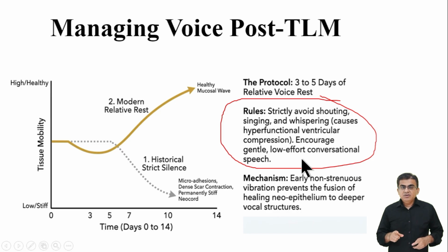However, you must give your patient very strict rules. They must absolutely avoid shouting, singing, and clearing their throat. Most importantly, you must strongly warn them never to whisper. Whispering is very dangerous after laser surgery. Whispering causes the throat muscles to squeeze too hard. This badly damages the healing surgical areas.